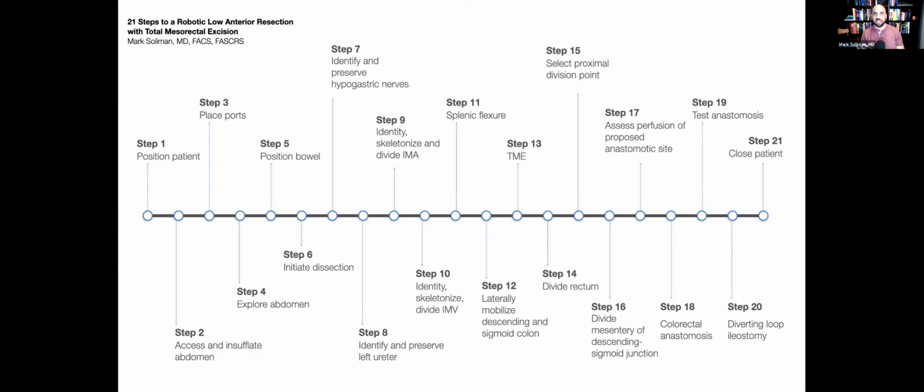I'll pause here and just say, take your time in docking the robot. It gets frustrating if you don't first laparoscopically position the patient and the bowel prior to docking the robot for rights or lefts. So just make sure things are set up prior to docking.